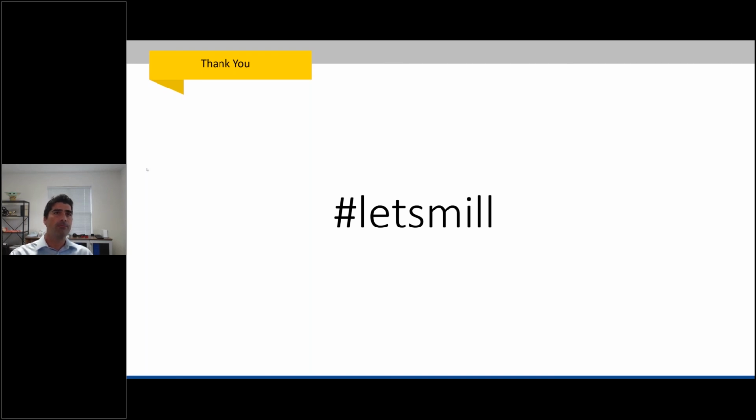Okay. Next question is regarding the release notes. Once you click out of that release note, there's a pop-up. Is there anywhere on the website or inside the Millbox software that we can refer back to what those release notes were? Yeah, that's a great question.